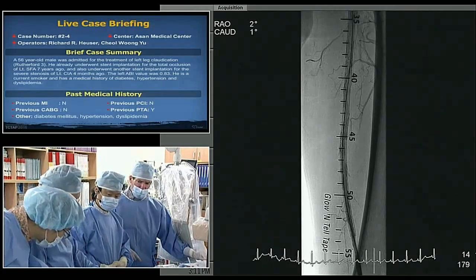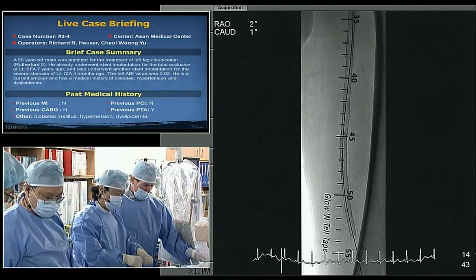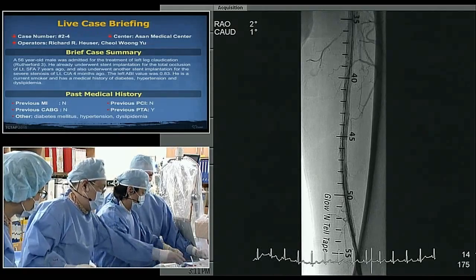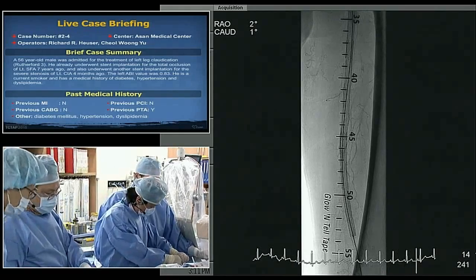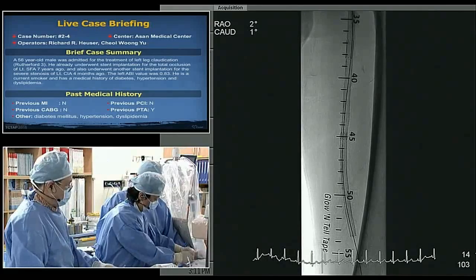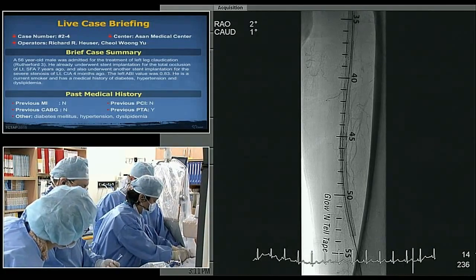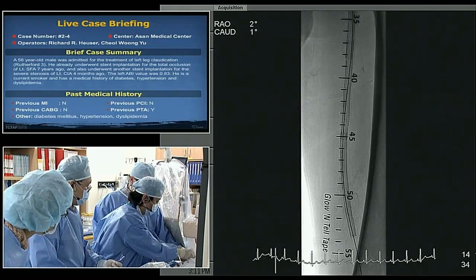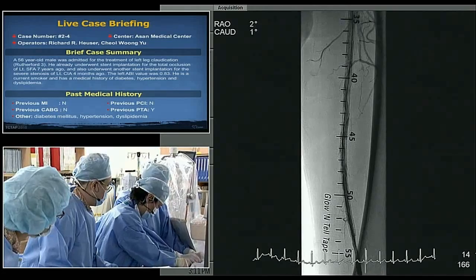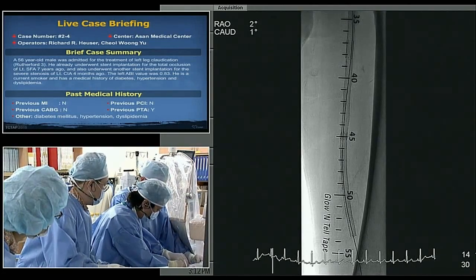So we're going to go with a Medtronic IN.PACT. We have a 6.0 by 120, so I think we're going to use probably 2 of those. I like this protective cover they have over it. We don't get that with the VAR device, and I'm afraid my sticky fingers sometimes touch those drugs. So this is nice. It's all yours. Okay, is it going in?